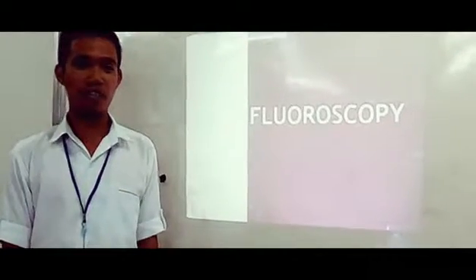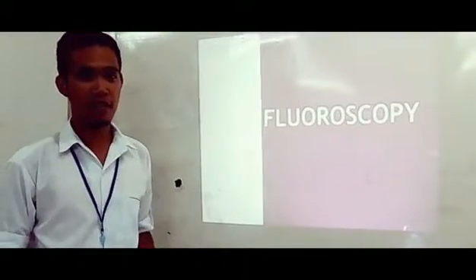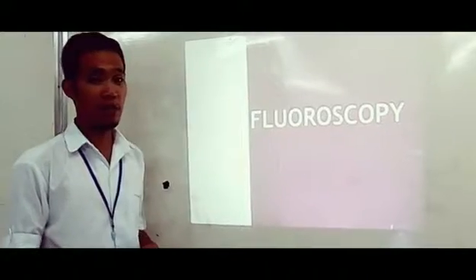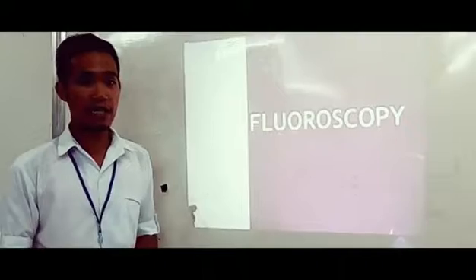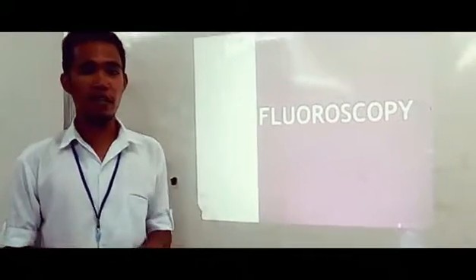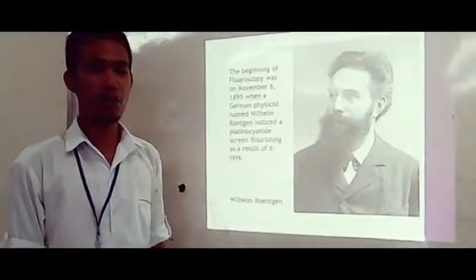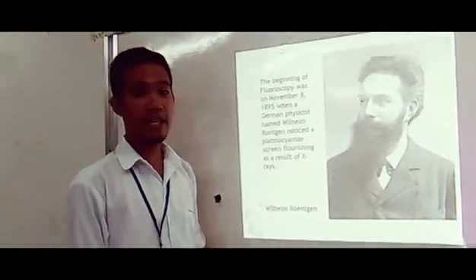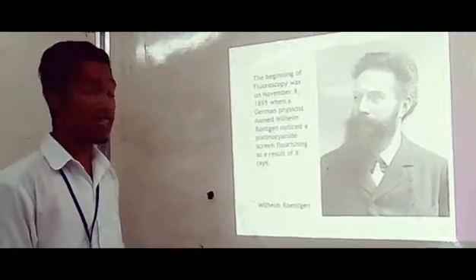We are the SSTU biologists and we are about to tackle fluoroscopy. What is fluoroscopy? Well, it is the study of moving body structures, similar to an X-ray movie. A continuous X-ray beam is passed through the body parts being examined. The beam is transmitted to a TV-like monitor so that the body part and its motion can be seen in detail.